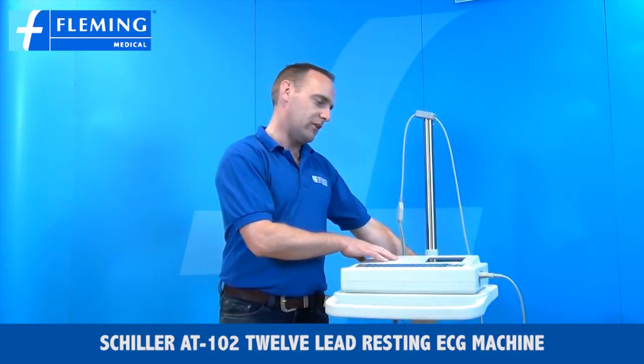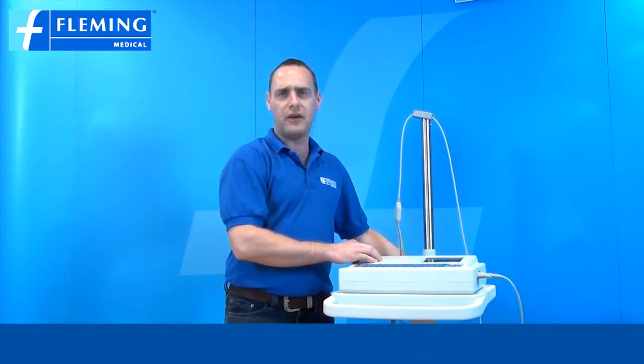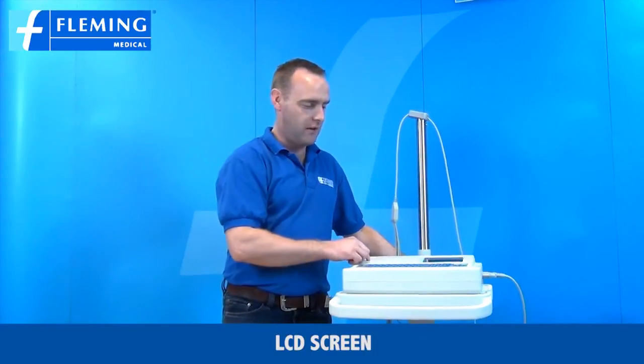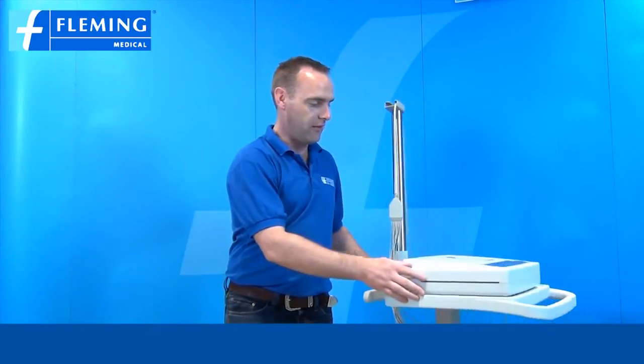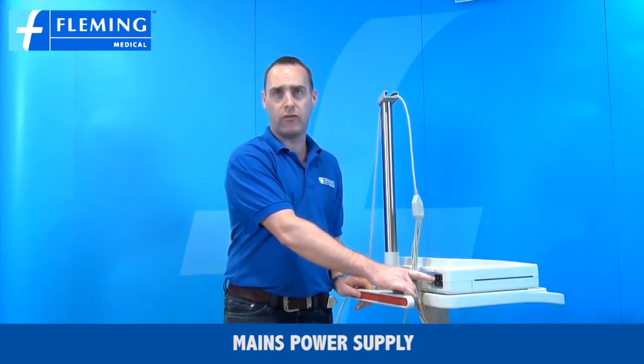This is the Shiller product. It comes standard with memory and interpretive software, LCD screen and an A4 printout. It also comes standard with an inbuilt battery and a mains power supply.